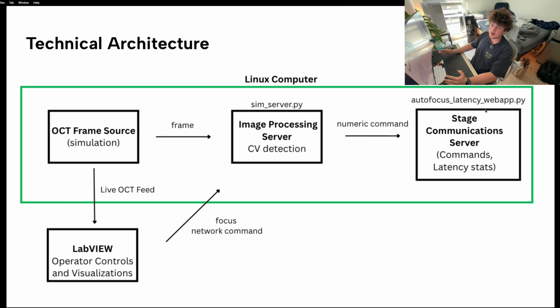This is going to be a walkthrough of the technical architecture behind the autofocus system that we have developed so far. You have your UI, which in our case is LabVIEW. LabVIEW can live on any computer because the main services all live on one single Linux computer. The Linux computer drives three main services. First one being the OCT frame source, which is where the frames are coming from.